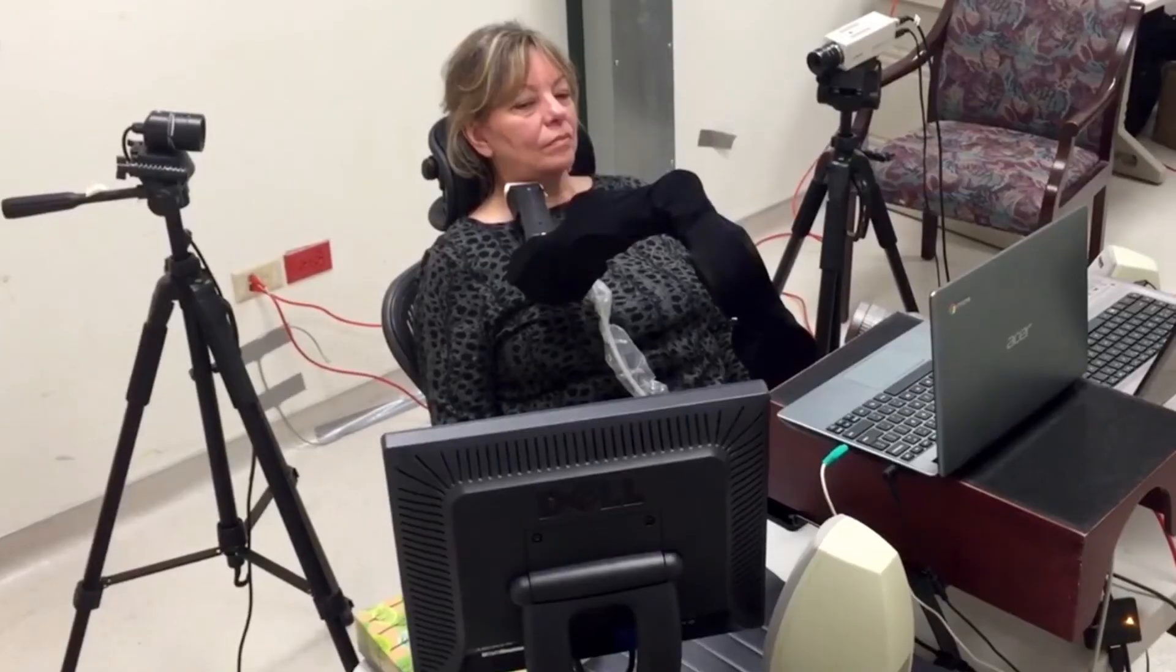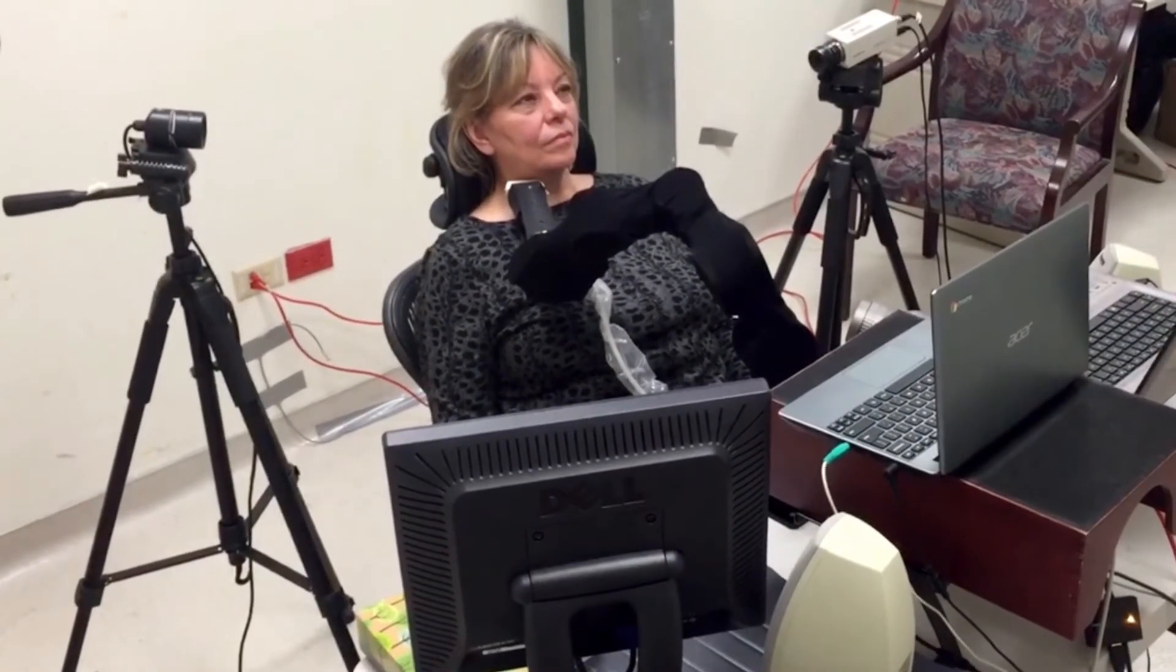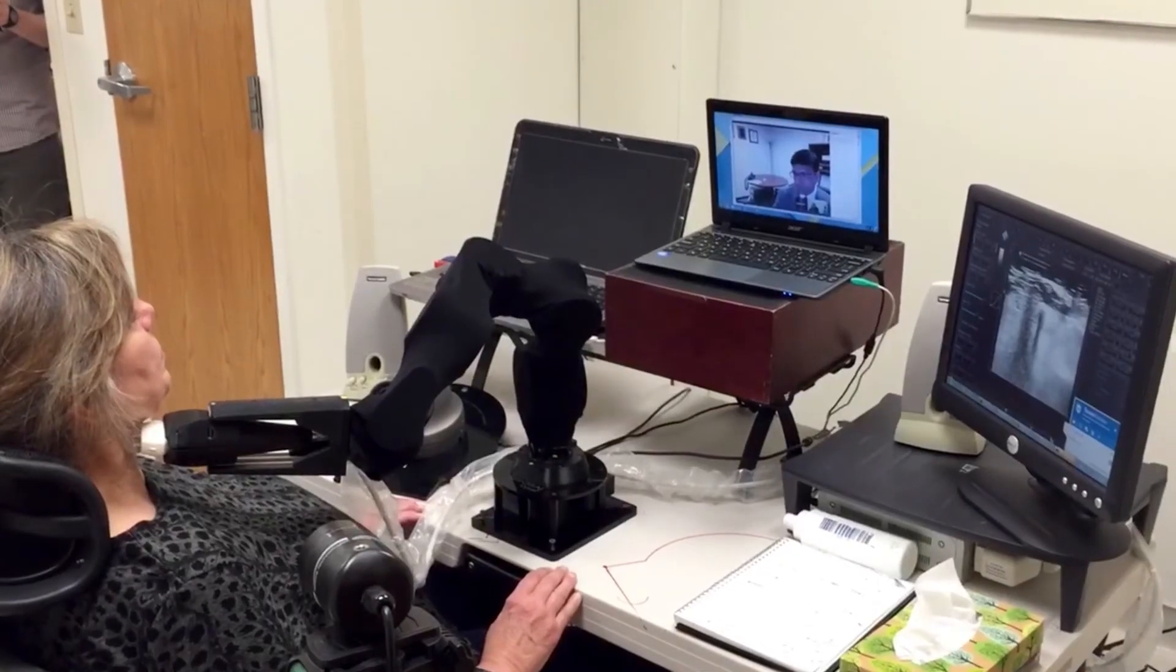Ultimately, we're looking at other applications, including aortic valve replacement, other types of heart procedures, and other types of ultrasound procedures that could be done for the GI tract, for the musculoskeletal system, the nervous system.